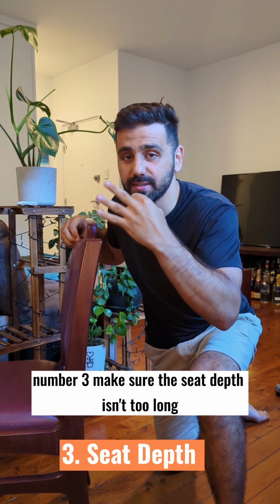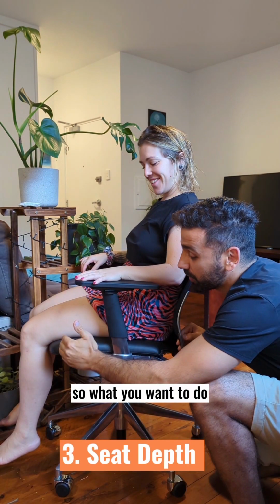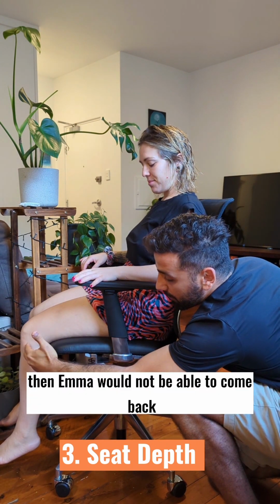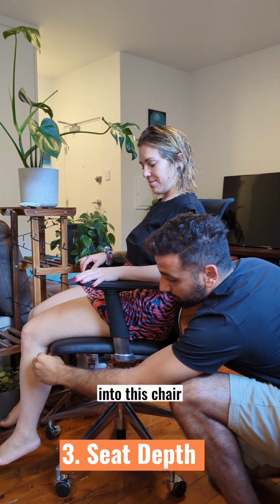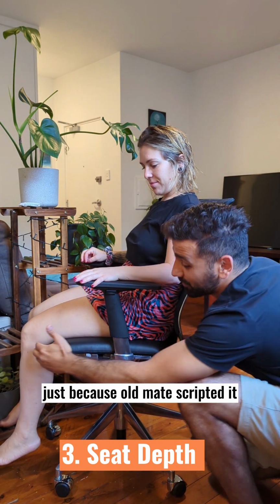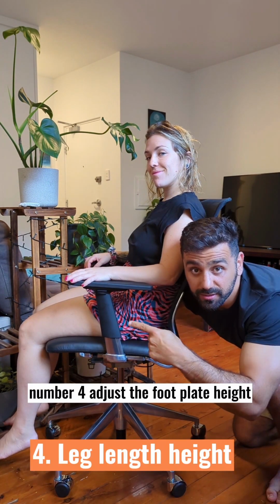Number 3, make sure the seat depth isn't too long. I'm gonna need my assistant. So what you want to do is make sure the seat depth isn't too long. If this cushion was 2 inches longer, then Emma would not be able to come back into this chair because the cushion would stop her knees from coming back. Just because old mate scripted it 2 inches long on the previous chair doesn't mean you have to do the same thing.